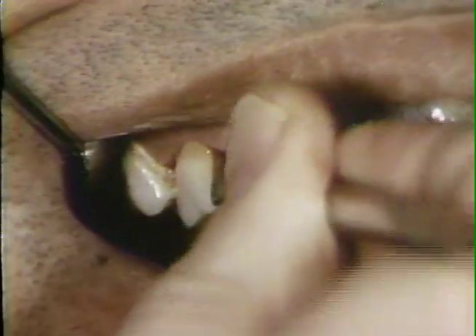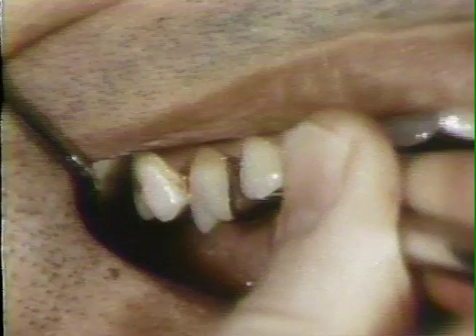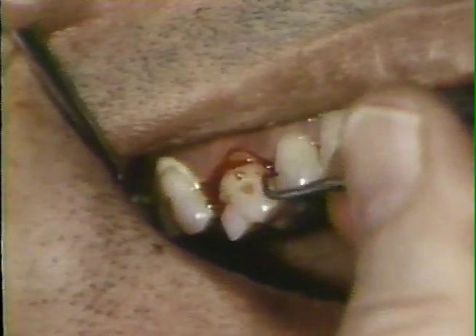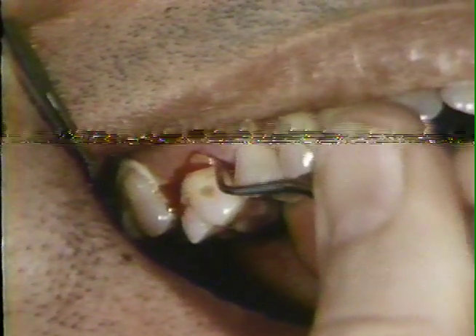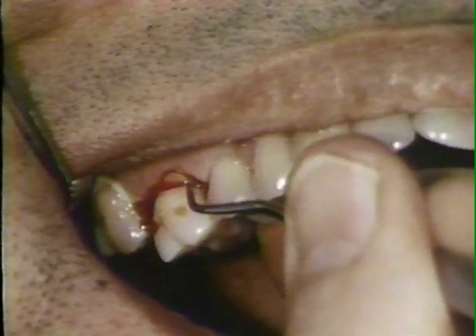Periodontal files are excellent instruments for smoothing the cemento-enamel junction and for the initial reduction of gross roughness on the root surfaces. Following the use of periodontal files, the root surfaces should be planed with a curette or sickle type of scaler.